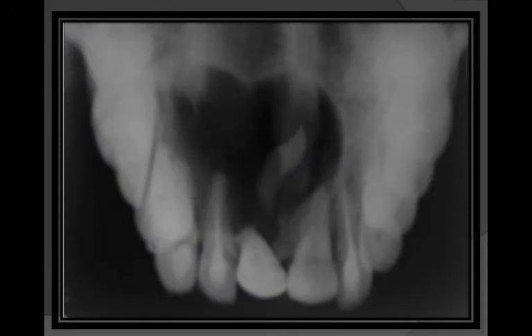To determine the medial and lateral extent of pathology and to detect disease of the palate or floor of the mouth. See in this image we see a clear nasopalatine cyst.